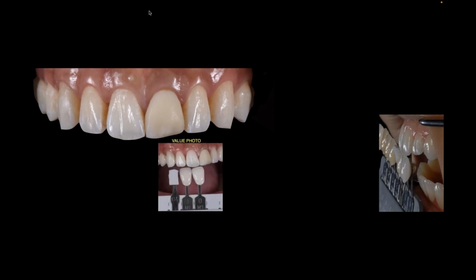So we're going to try to make that bigger space look smaller by creating the right contour and shape and surface of the tooth. I start with my value photo, just like I said before. So I'm looking at the number 8 as my reference and finding where the value is for that tooth. But I'm also looking at the translucency, and you can see that that tooth has a lot of translucency on it. So in order for me to get to that translucency, that's why you see an OM3 guide in there. It doesn't really look as bright as an OM3, does it? But yet it's very translucent.